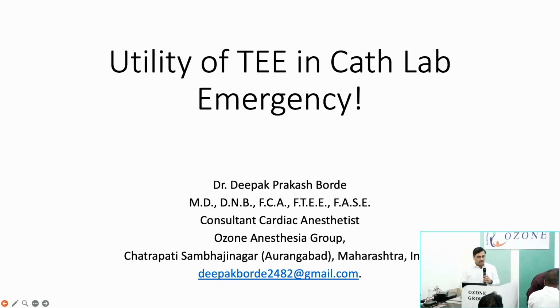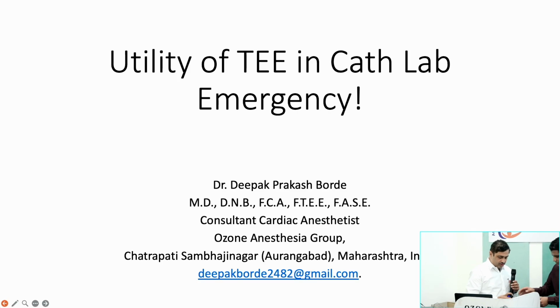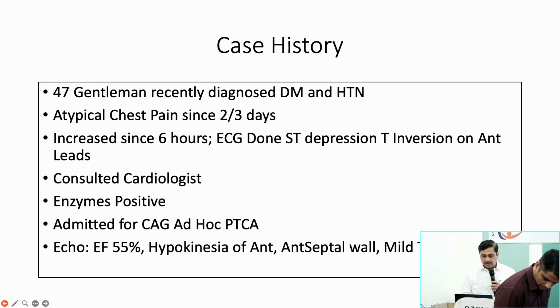What is the utility of TE in an unusual situation, or when you come across an emergency situation in the Cathlab or somewhere? That is what I'm trying to demonstrate. This was a 47-year-old gentleman, diagnosed with diabetes and hypertension.